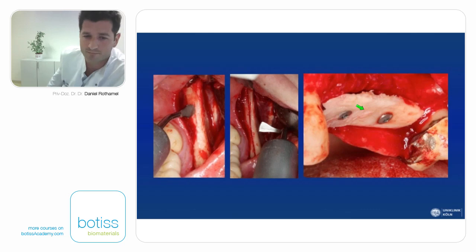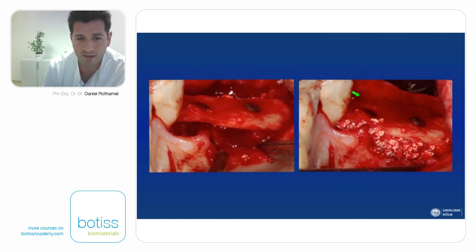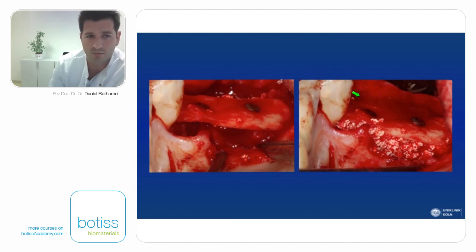We went to the posterior mandible, and we took a very thin bone graft from this ramus region that perfectly fit to the recipient site. You can easily see that in this area, this is a very long and thin bone block, and with these angulated tips of the Piezomed, we can easily perform the preparation exactly like we want to graft the block in the recipient area. Not a big bone defect on the lateral aspect, but when we look from the palatal side, a large bone defect in this area. So we have a lot of stability from the bone block. Therefore, we can just use some cerabone particles underneath in combination with some autogenous bone.